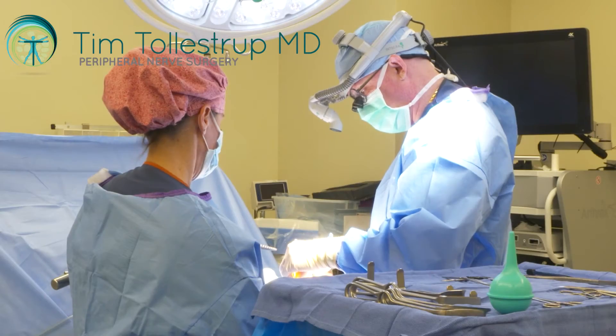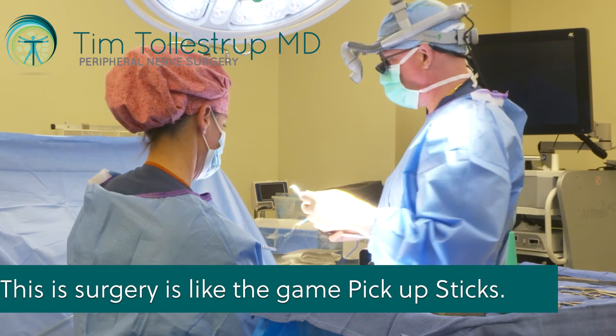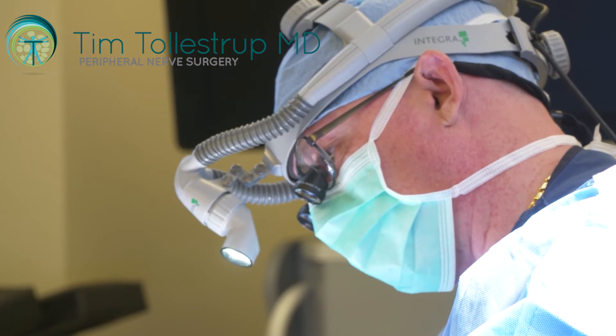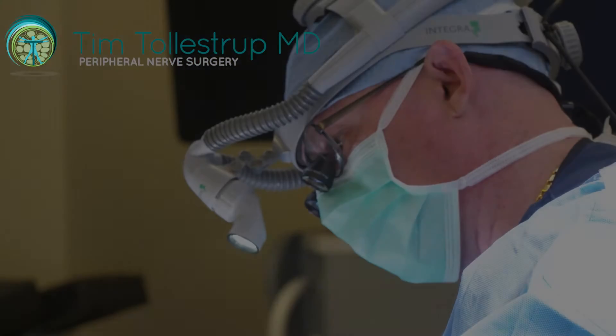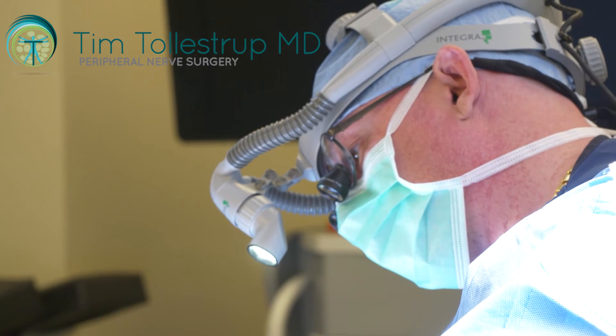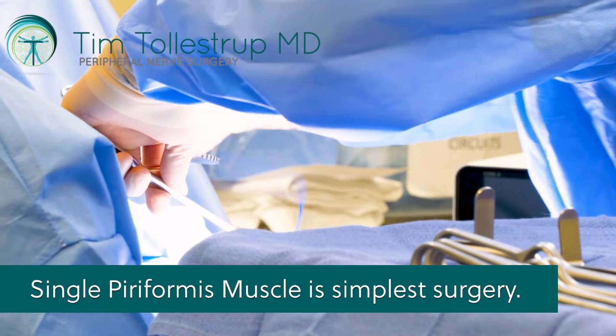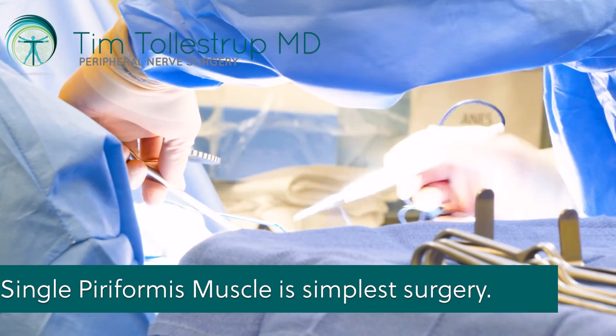This surgery is a little bit like that game you played as a kid — pick up sticks. It's all about trying to remove these muscles that are all intertwined with the nerves. If you have a single muscle, which is the most common configuration, it's much more straightforward.